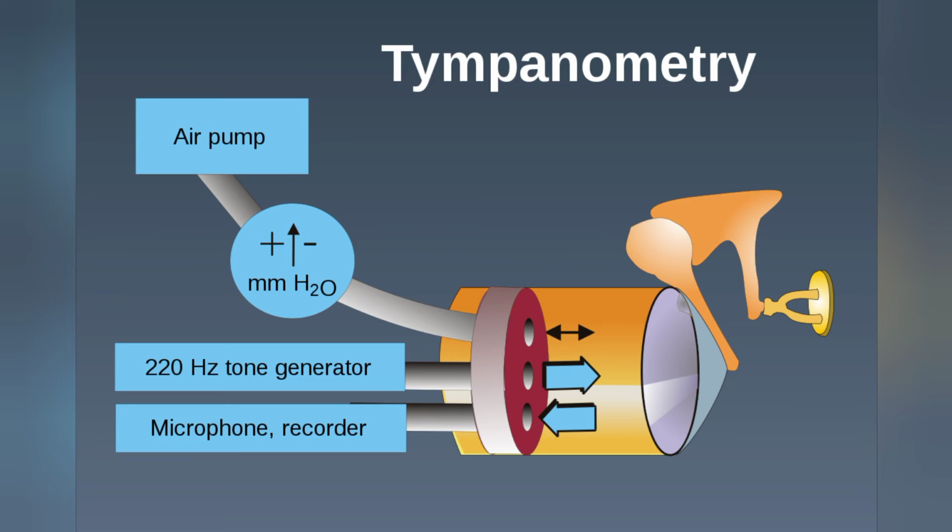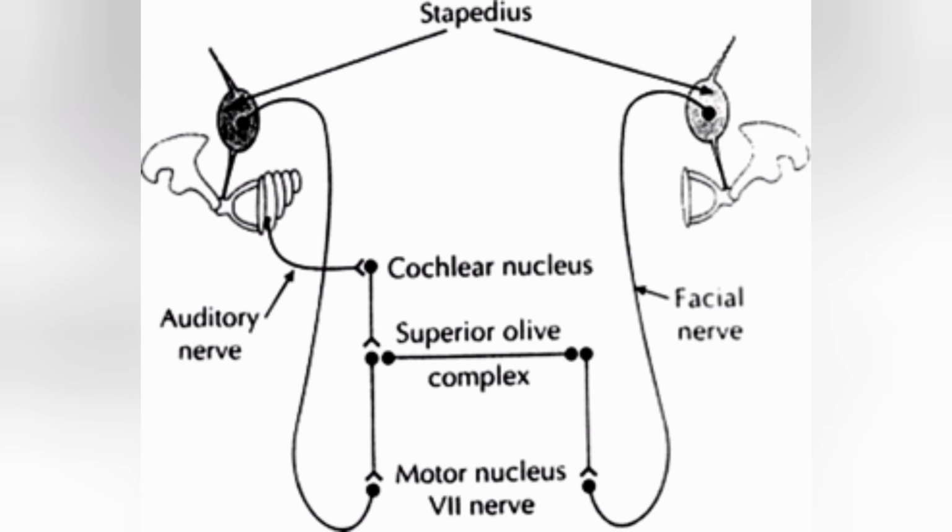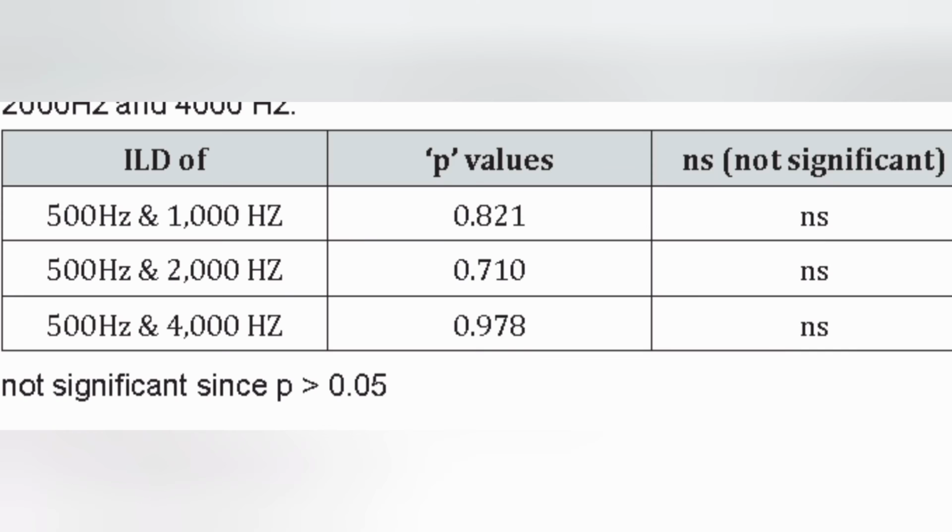Tympanometry is based on measuring the acoustic resistance and pressure in the middle ear. It is performed by changing the pressure in the external auditory canal to obtain such pressure that prevails in the middle ear. This causes the impedance of the middle ear to be smallest and the compliance of the tympanic membrane to be the greatest. Next, the stapedius reflex test is performed automatically by providing middle and high frequency stimulus sounds, that is at 500, 1000, 2000 and 4000 Hz frequency.